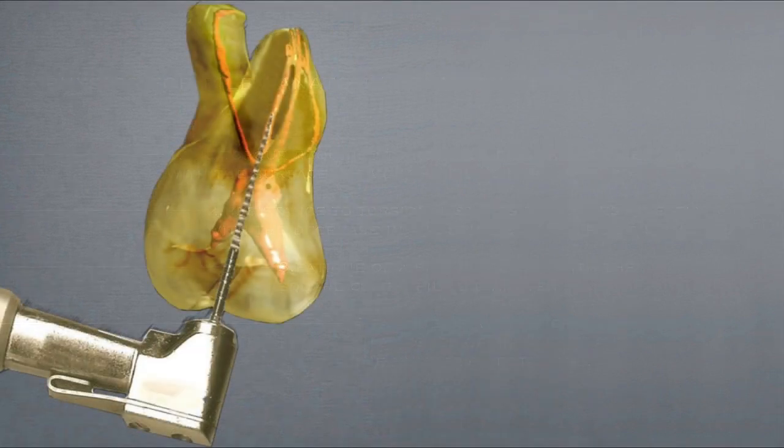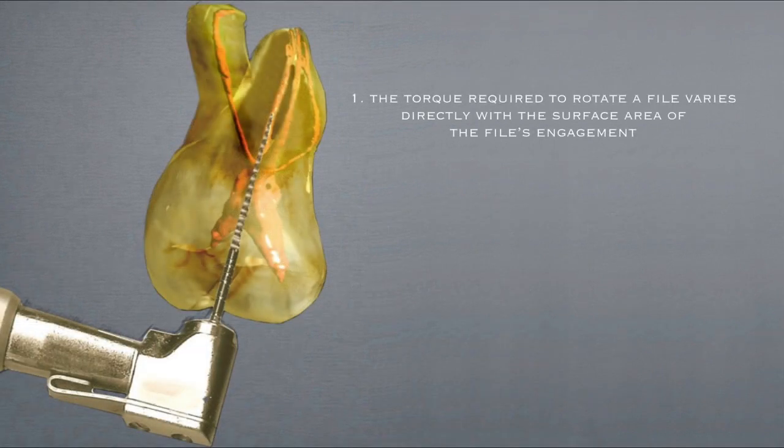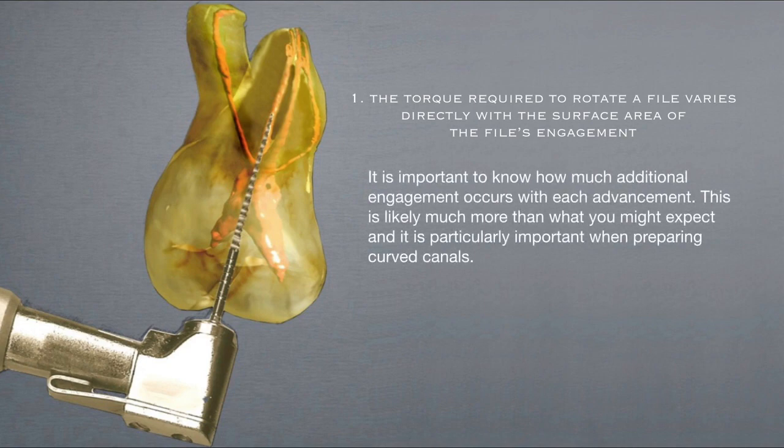Let's examine the first relationship. The torque required to rotate a file varies directly with the surface area of the file's engagement. It's important to know how much additional engagement occurs with each advancement. This is likely much more than what you might expect, and it's particularly important when preparing curved canals.